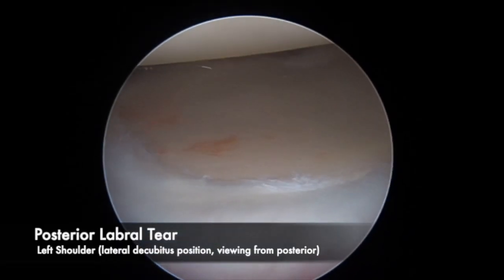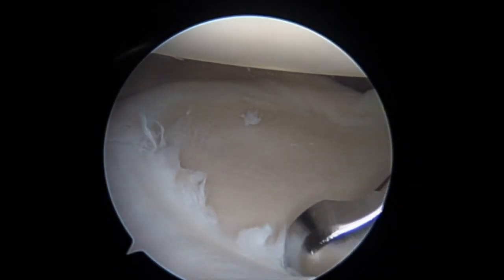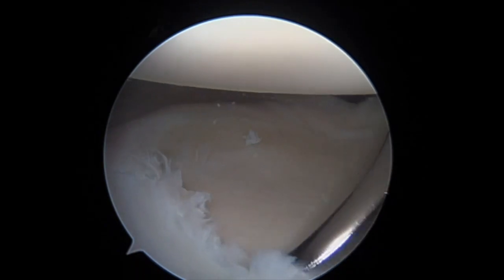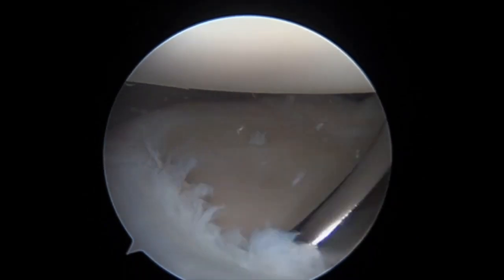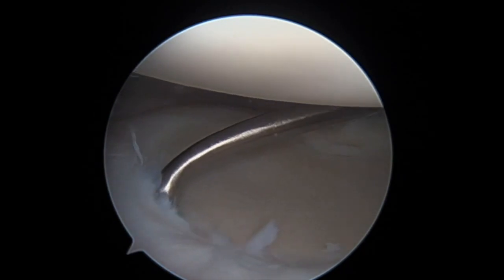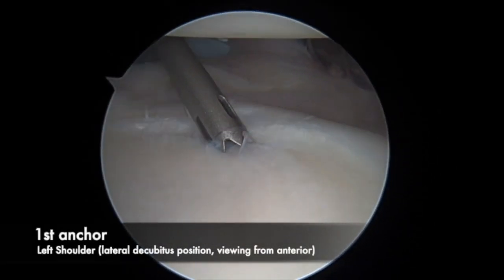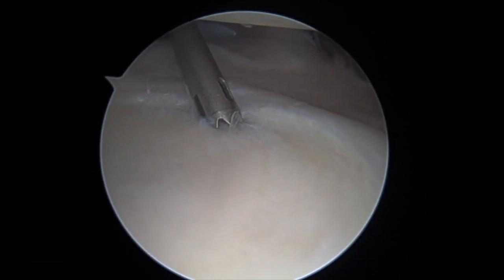Diagnostic arthroscopy is performed in a lateral position demonstrating a posterior labral tear on a left shoulder. A standard posterior lateral portal is used to visualize, while the anterior portal is utilized to aggressively liberate and debride the frayed labral edge back to a stable tear pattern. An accessory posterior lateral portal, as described by Romeo and Proventure, is performed.